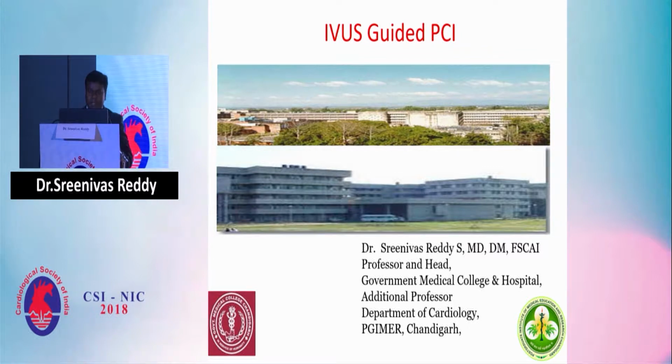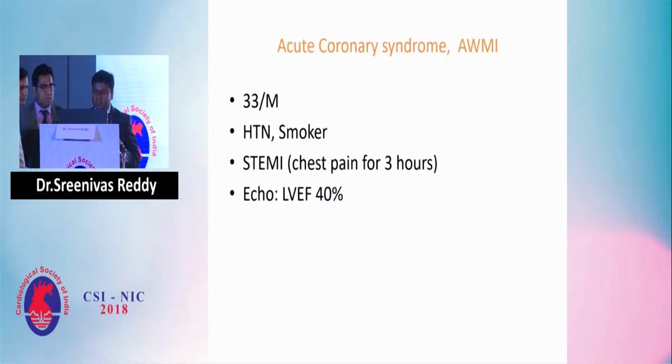So in the next 30 minutes, I would like to discuss, because it's a continuation of the previous talk, where the previous speaker has spoken about the equipment. I would like to show you how IVUS-guided PCI helps in understanding the morphology, the plaque characteristics, and how to optimize the outcome. So I would like to go from the simple to the complex cases.